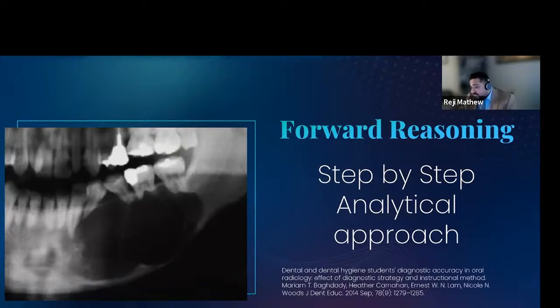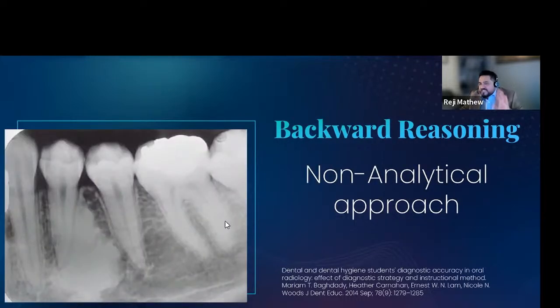maybe two, or maybe even three differential diagnoses. Not more than that, because we could see a benign pattern, we could see a malignant pattern, we could see all those changes in the bone much more clearly, three-dimensionally. So that's one.